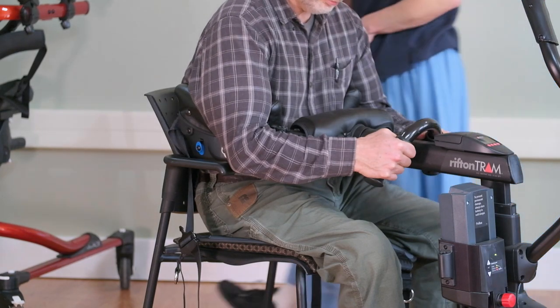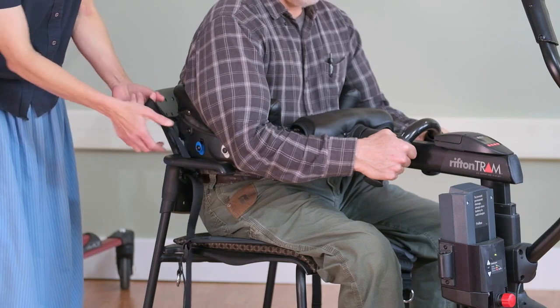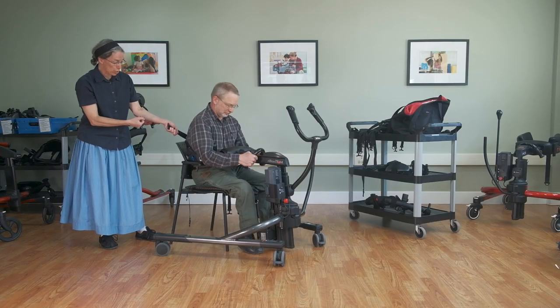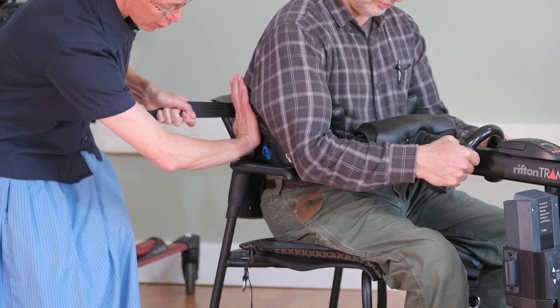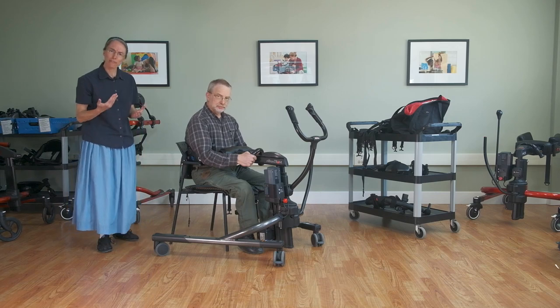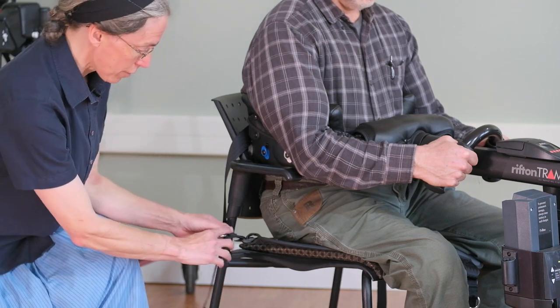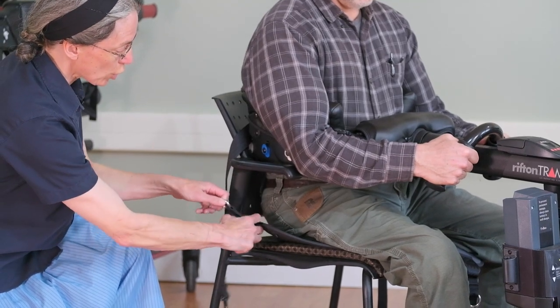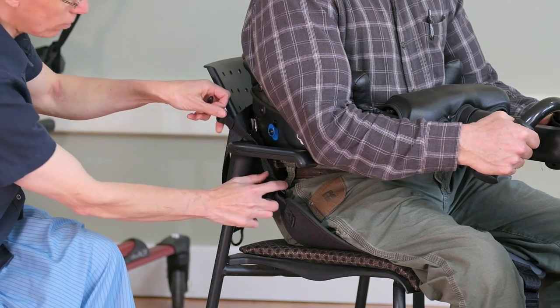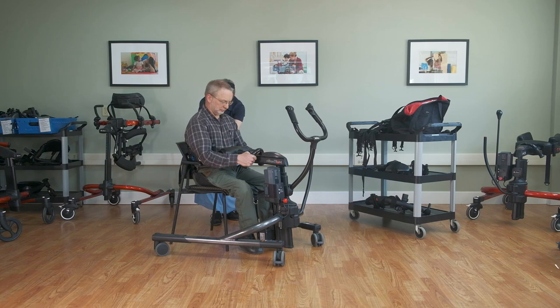Set the brakes. A good rule of thumb is that the lower part of the body support system is just above the iliac crest — really low and snug. Take the strap at the back and pull it one way while pushing the body support system the other way to get it really snug. Another rule of thumb: if it's difficult to slide your hand between the body support system and the student's trunk, it's certainly tight enough. Then we have the ring clip, which secures onto the colored clips on the body support system — choosing either the gray or the blue so that it's farther back will give a good support surface.